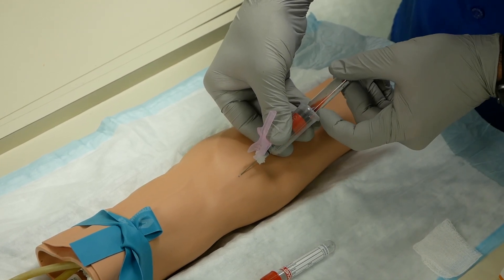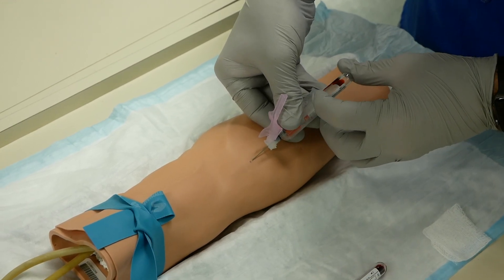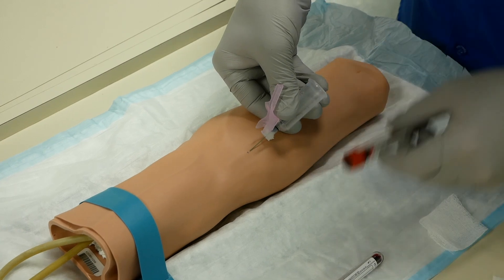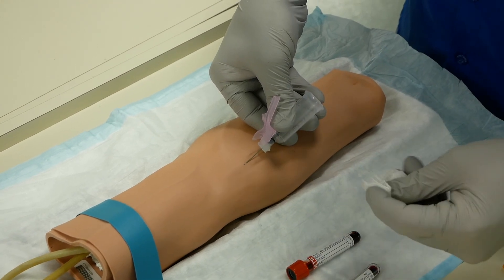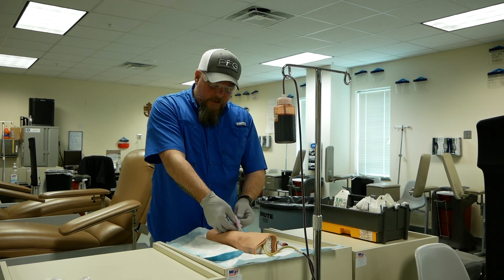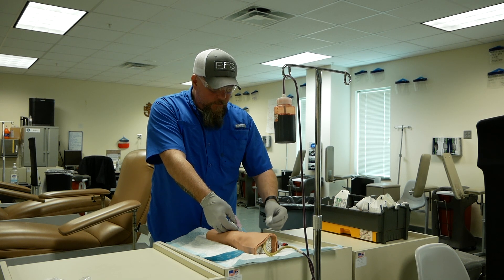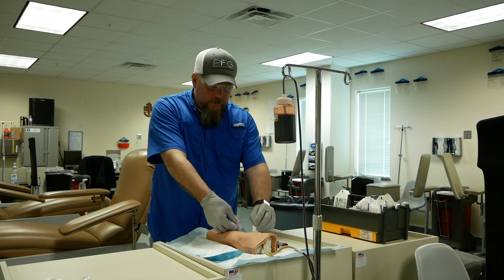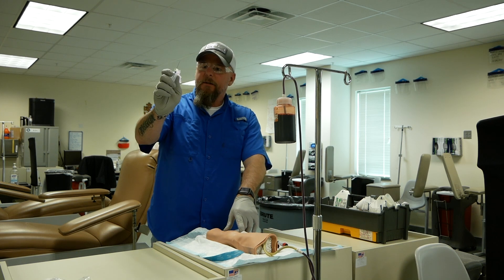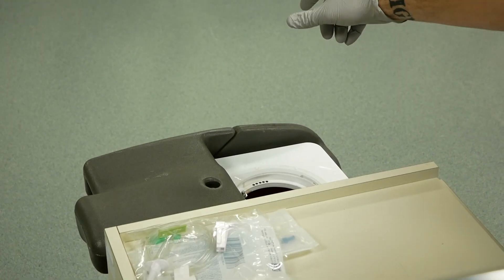Your instructor will tell you that your tube is full. Carefully remove the tube from the vacutainer holder without pulling the needle out, then puncture your second tube. Your instructor will then tell you this is your last tube and it is flowing freely — that will tell you to release the tourniquet. When the tube is full, pull it out again without pulling the needle out. Grab your gauze, fold it in fours, and hold it above the site. Remove the needle quickly, apply pressure with your gauze, and safety your needle with your thumb. Needle into the sharps container.